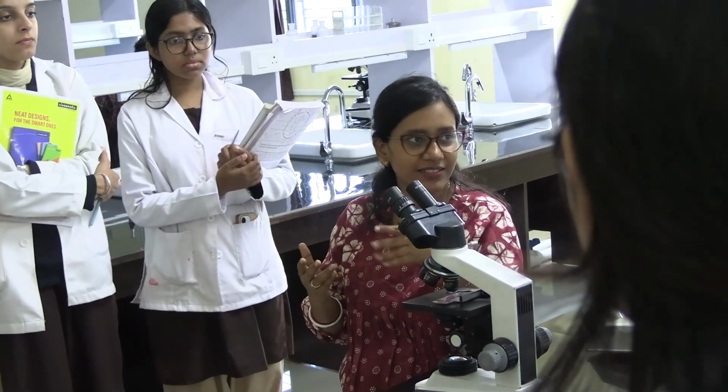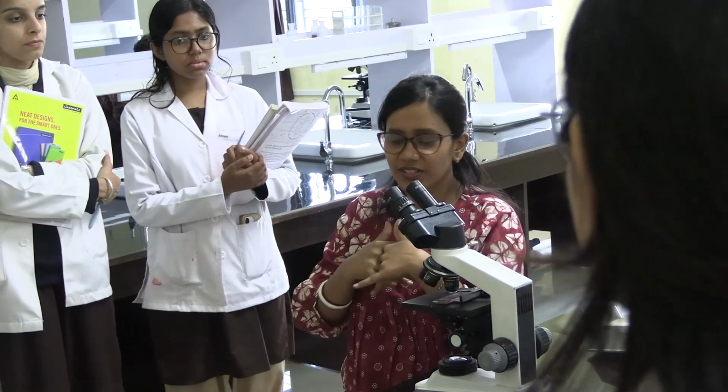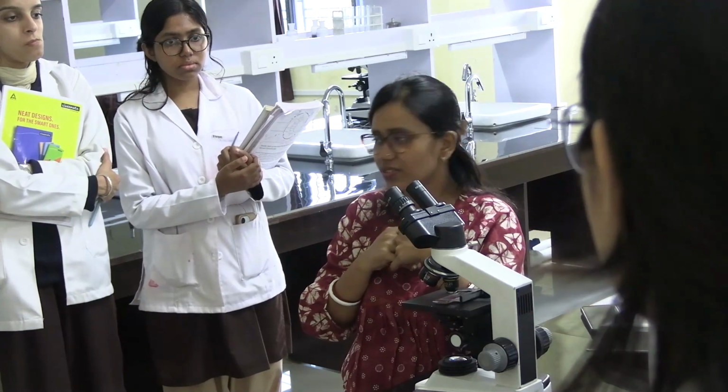This is very basic. It's not even like I've asked you some final year question. It's first year histology questions. Okay. So now we know adenocarcinoma arises from the glandular epithelium. Examples of organs are stomach, anything in the GIT per se, and also liver.